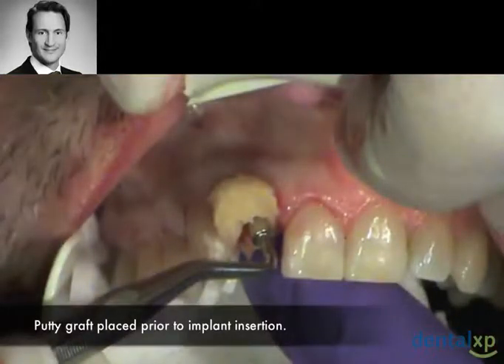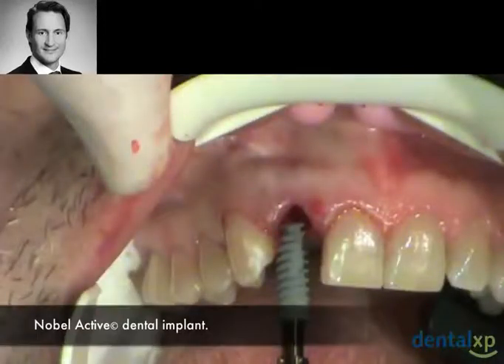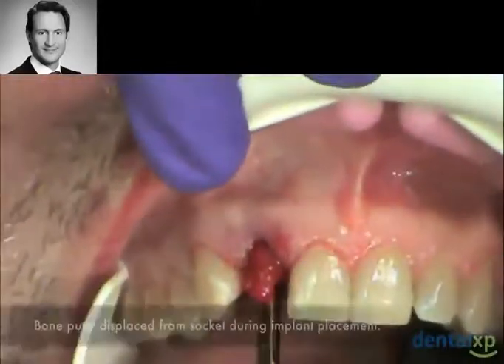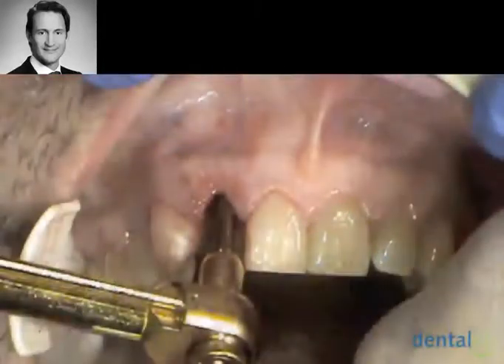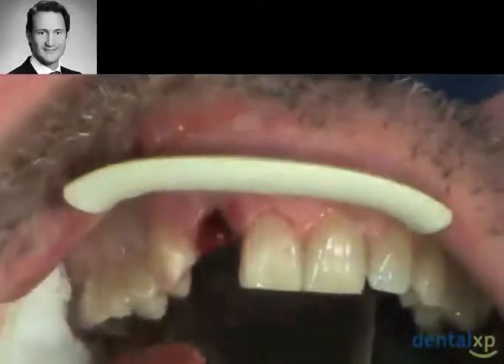In this case, I utilized bone putty with cancellous chips, and this is packed into the socket. The Noble implant that we'll be using is selected, and it is placed into the putty graft. The graft is displaced out the buccal, and the implant is then seated to full depth with a torque driver.